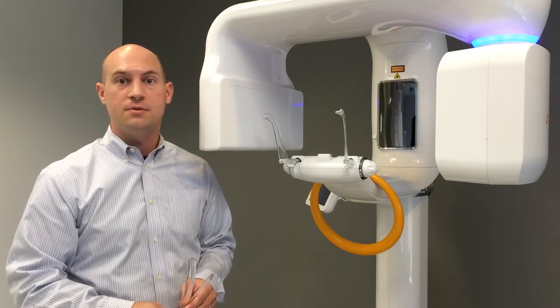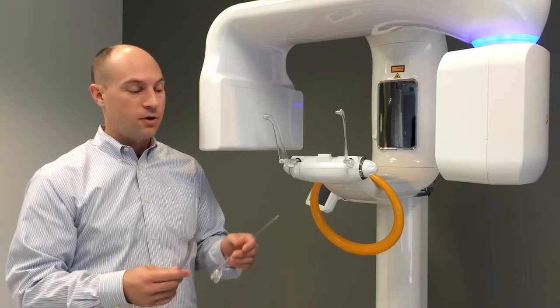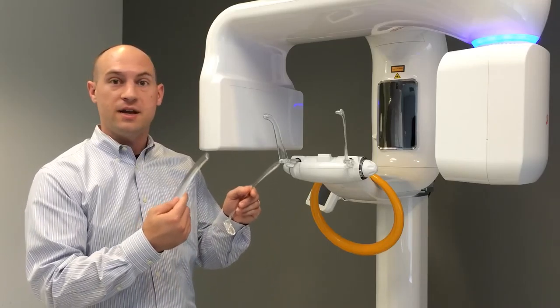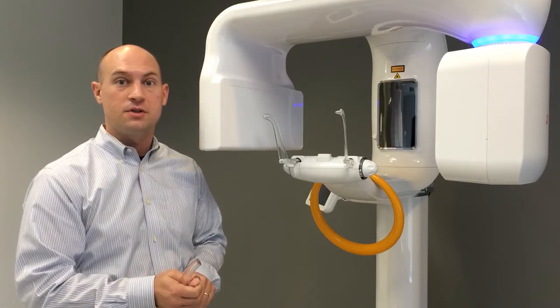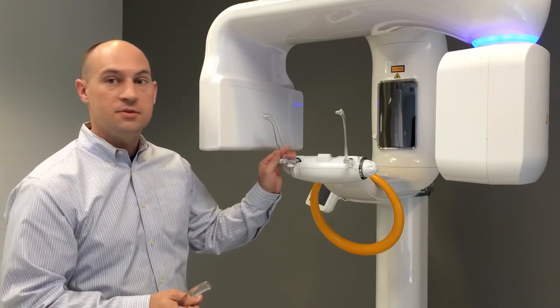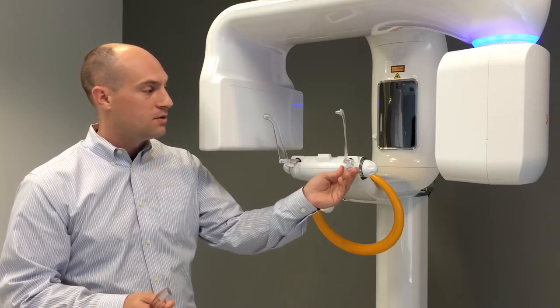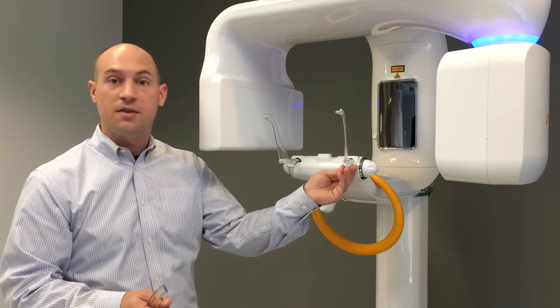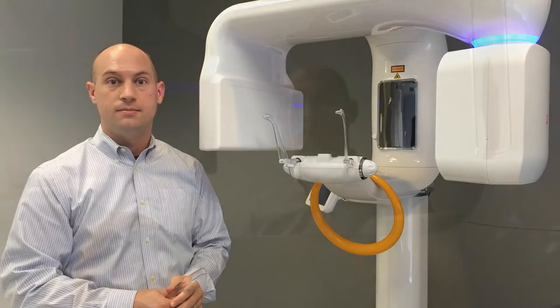Before we position our patient for a two-dimensional TMJ acquisition in the RayScan Alpha, we need to first prepare the machine. I've already removed the standard temple supports from a standard pan or CT acquisition, and I've installed the TMJ headrests on both the left and right side by loosening and tightening the thumb screws underneath. Now we're ready to put the patient in.